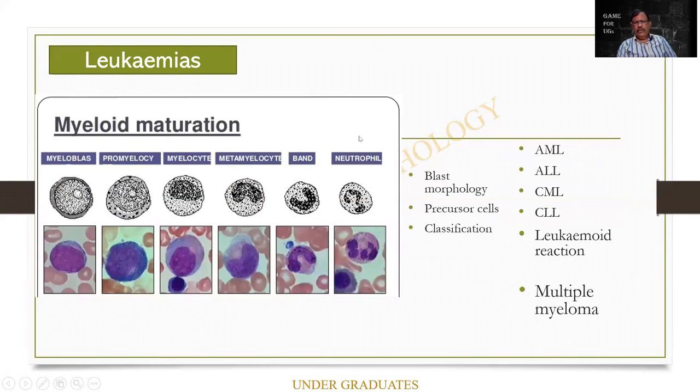Maturation, because this I use as an exercise. I ask the student to draw a picture of a myelocyte, a myeloblast, a promyelocyte, etc. It is not very difficult. I have done it n number of times. I'm repeating it again. The myeloblast is a large cell.